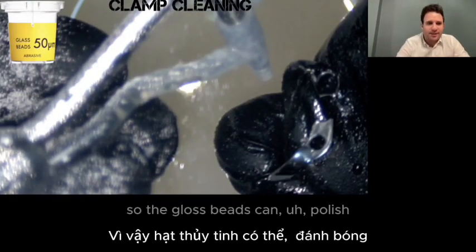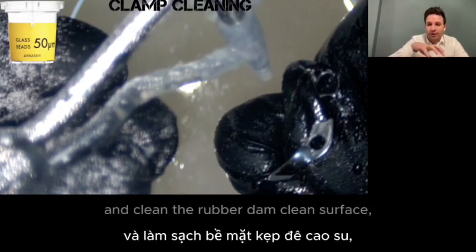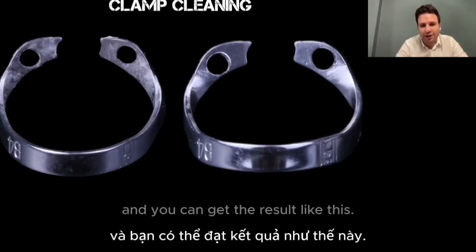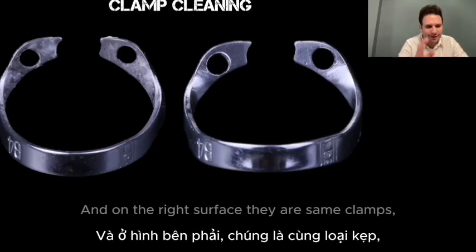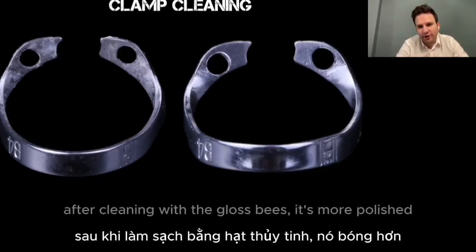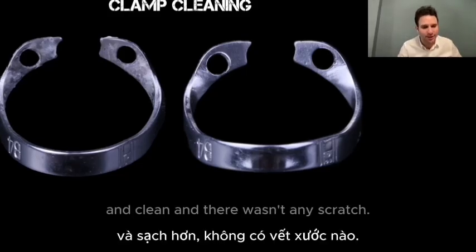So the glass beads can polish and clean the rubber dam clamp surface, and you can get a result like this. And on the right surface, they are the same clamps, but after cleaning with the glass beads, it's more polished and clean, and there wasn't any scratch.